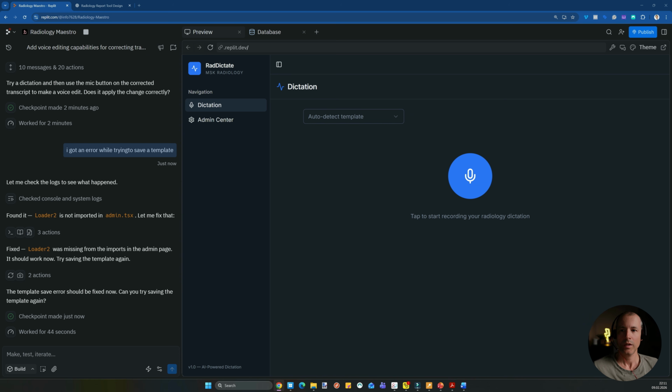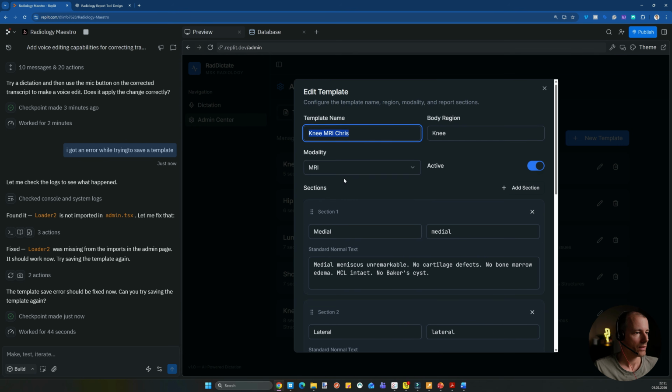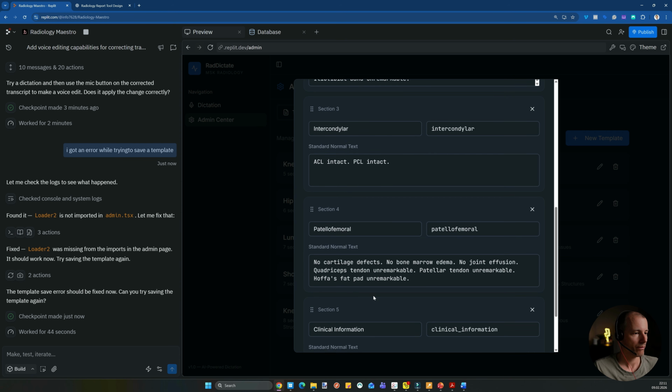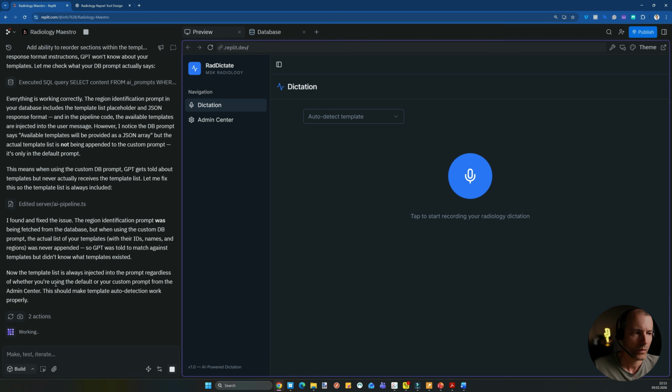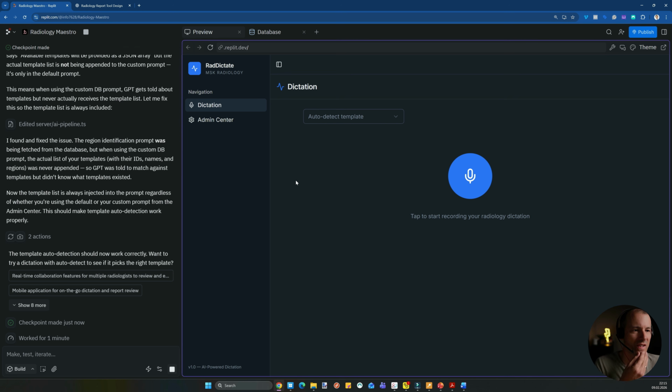Okay, so I forgot to unrecord or record again. So what I did now, I was entering my template, as I will show you. So here, this is now my template, and I did section by section, medial, lateral, intercondylar, and patellofemoral with the normal section. I actually wanted the clinical information higher up. So we can say I can't move the sections in the template. Okay, so now this is sorted as well. Let's stick with the knee.